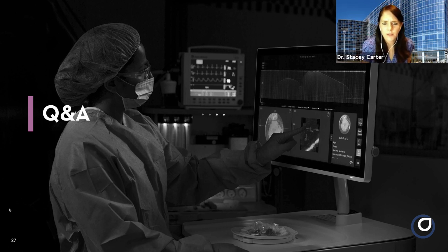I see another question, and it says, are the images analyzed by the radiologist or the surgeon? Great question. The surgeon actually does all of the OCT evaluation. It's live, it's in the operating room with you. You excise the specimen, you would x-ray it to make sure again that you've got your clip and your localization device in there, and then you would put it on the OCT device and scan and look for your margins, and you could know within minutes whether or not you need to take additional margins because it's close. So there's no involvement of radiology.